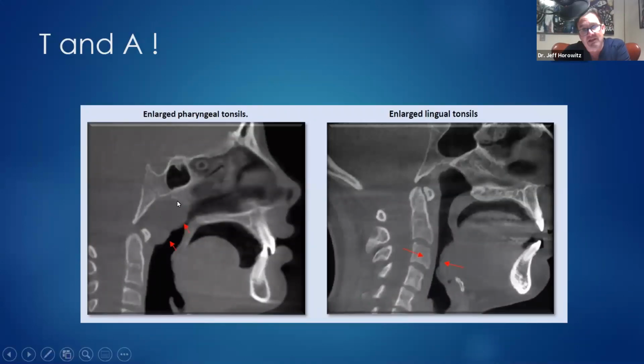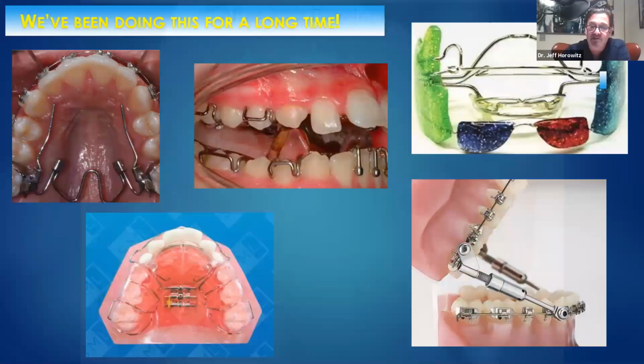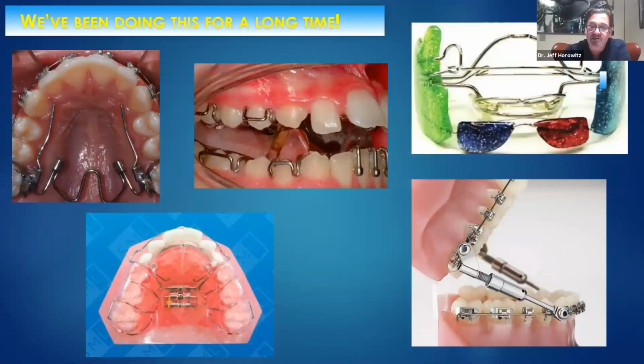So important to see that we can look at adenoids. The only other way to look at adenoids is going to be to shove a mirror back behind the tongue. I'm not doing that on young children. We can also see all the tonsillar tissues that surround the tongue and the pharyngeal airway and look for potential problems. This becomes a great referral tool for your ENTs, or maybe to your orthodontist if you're not doing orthodontics yourself. So there's a lot of reasons. You're building up that networking for your practice. You're working with medical practitioners, offering referrals, and it's all because you were taking a scan at the beginning and offering your patients a comprehensive diagnosis that minimizes risk.